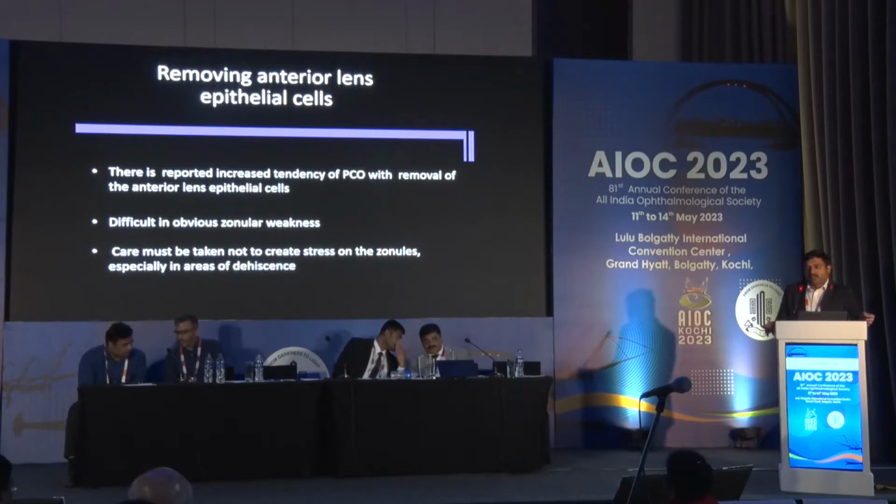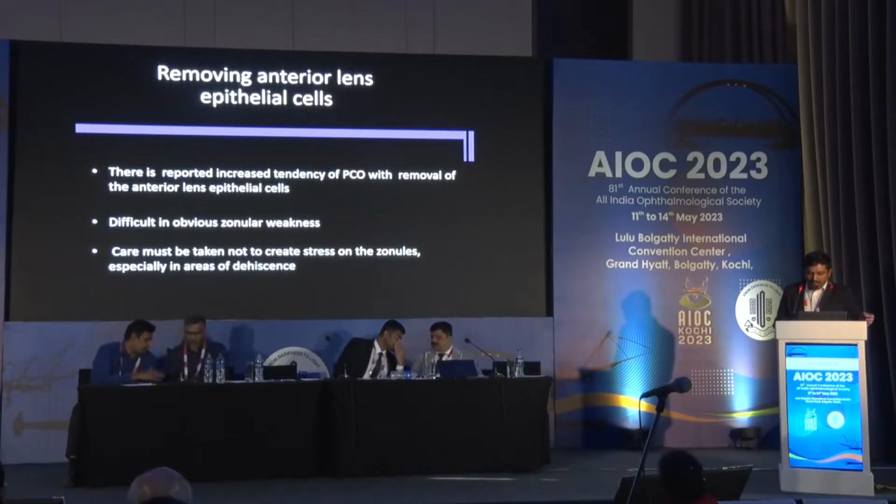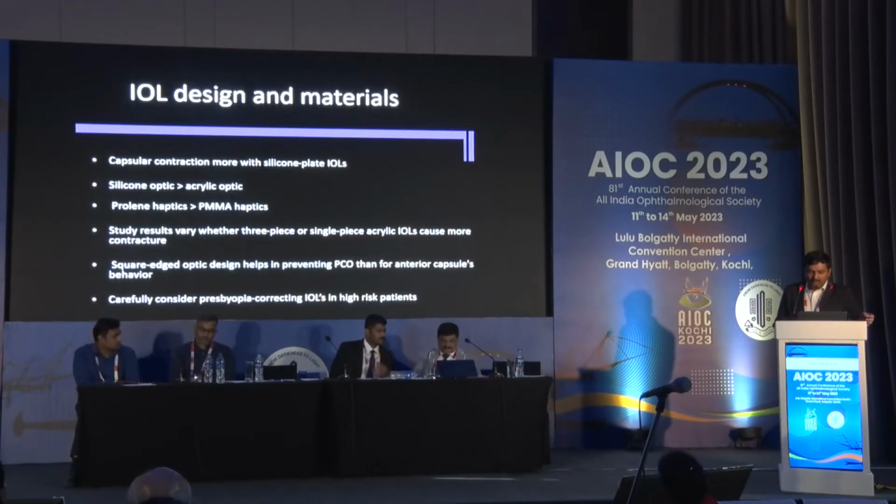But obviously when there is zonular weakness, the polishing of the anterior capsule may further damage the zonules and can hamper the surgical results. So one should be very careful with patients with zonular dehiscence or weakness.